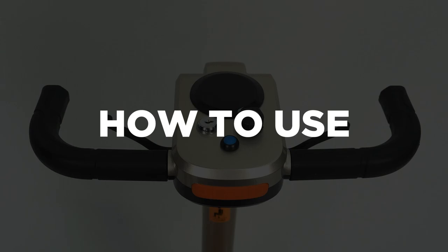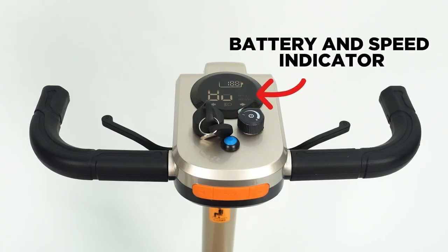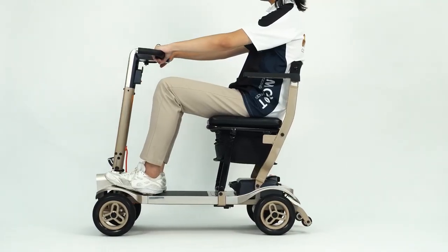How to use: Slot the key into the power ignition and push to power on the device. The battery and speed indicator will light up. Pull the lever on the right to move forward, and pull the lever on the left to reverse.